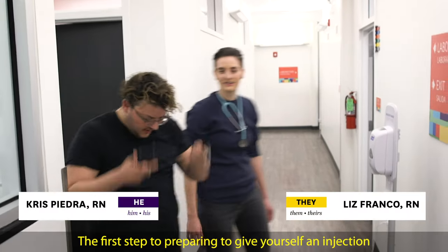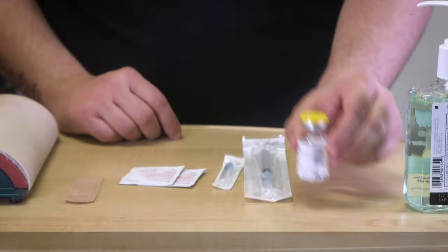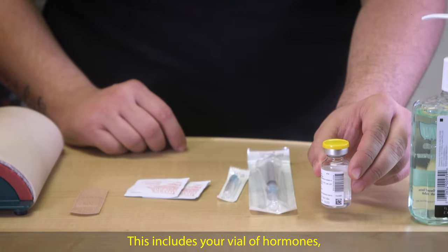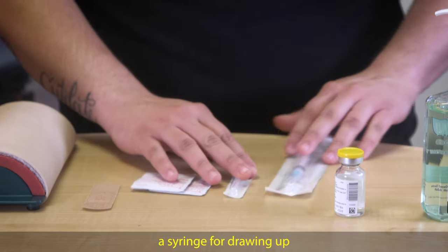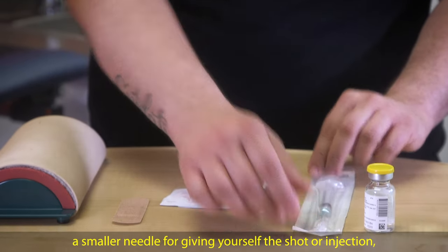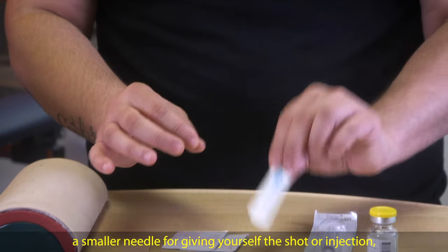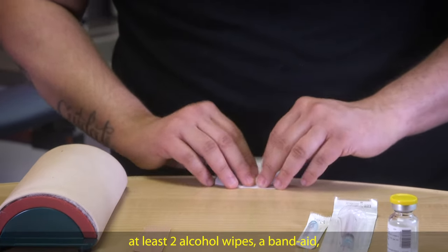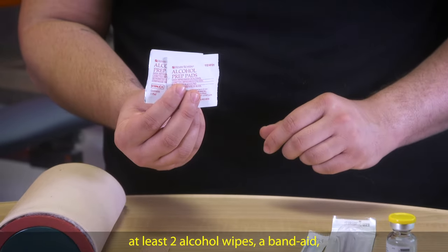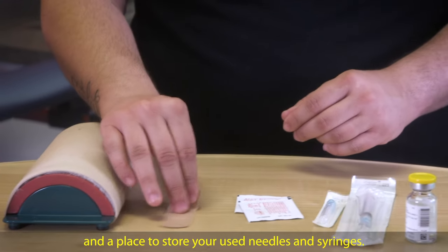The first step to preparing to give yourself an injection is gathering your supplies. This includes your vial of hormones, a syringe for drawing up or removing the hormones from the vial, a smaller needle for giving yourself the shot or injection, at least two alcohol wipes, a band-aid, and a place to store your used needles and syringes.